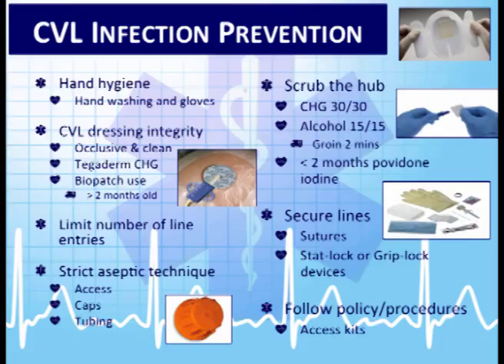In the field, this is important for us because many times we might be accessing the central line maybe to give one medication, or if they have a PICC line, maybe a pain medication. If we know we're going to be accessing that device more than once, it's better to hook up a fluid bag and just run it at a TKO or 25 mLs an hour rather than accessing the device, de-accessing it, and then 10 minutes later they need more pain medication or we need to give them an antiemetic and we're accessing it again. That's just increasing their risk for infection each time that line is accessed. And we'll practice that and talk about that a little bit.